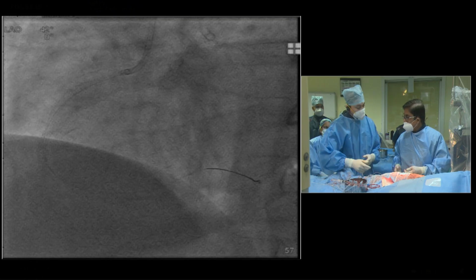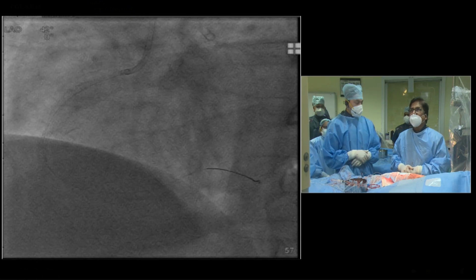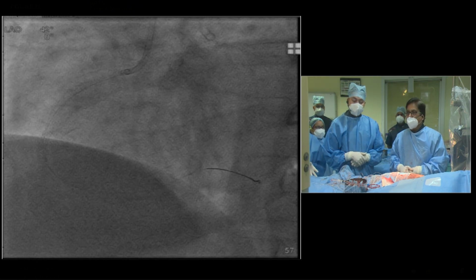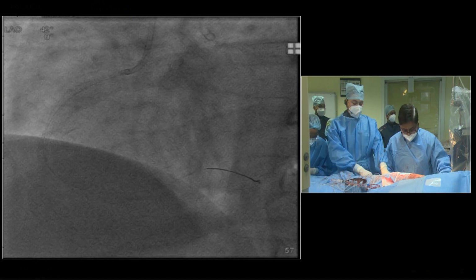Okay. Do you want some post dilatation, or you think it's okay? I think it looks okay. But I think the proximal part may need some post dilatation. I personally feel nothing is required because we wanted to stop. I think let us call it a day. Long stent, I think it must be post dilated. Let us see in the other view also. My biplane concept. Other view.